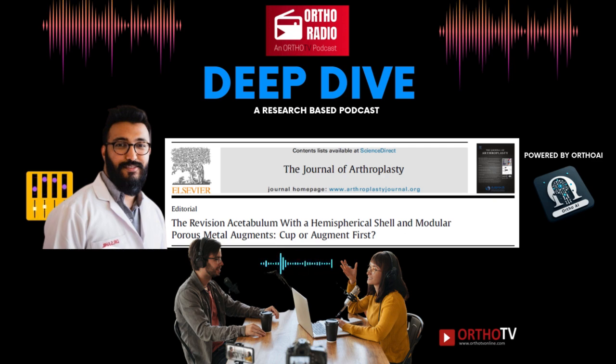I think the future is really exciting. We're seeing a lot of cool stuff with personalized medicine and 3D printing. Ooh, 3D printing. Like in the movies. Yeah, kind of like that. So we can use imaging to create a 3D model of the patient's hip, and then we can design an augment that fits perfectly. Oh, wow. Yeah, and that helps with support and bone growth. Like a custom-made suit. Exactly. For your bones. Pretty much.